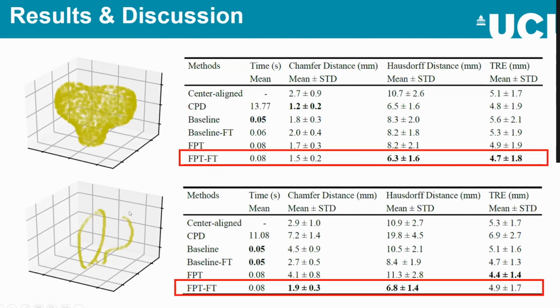And what we've got down here is our results when we've got just the 2 planes of points basically extracted from the imaging there. So while these numbers are quite great, it's good that we're ahead. It's another thing to note that when you look at conventional imaging methods, they often tend to have TREs somewhere in the range of about 1.5 to 3.5 millimeters. So when we look at the TRE here, you notice that that's maybe not quite as good as what we could have hoped for. But a lot of this is due in part to the fact that they've got not just the surface, but they also have the entire imaging data. Whereas here, we've really only just got these 2 lines of points to work with.